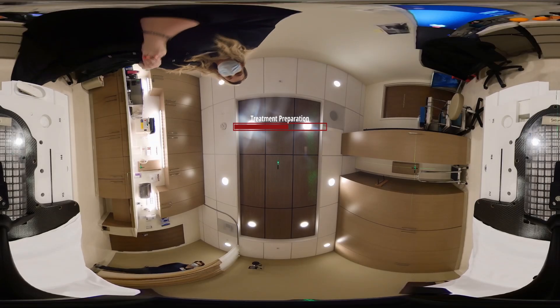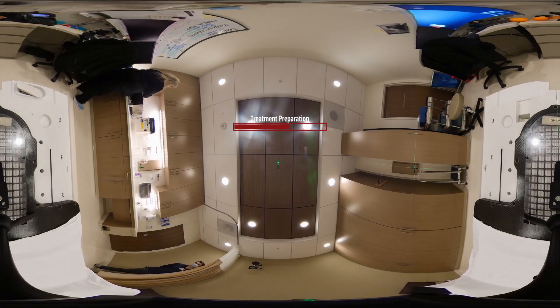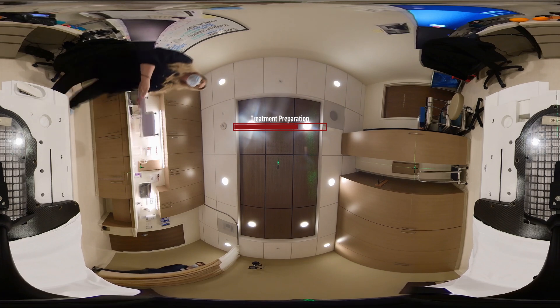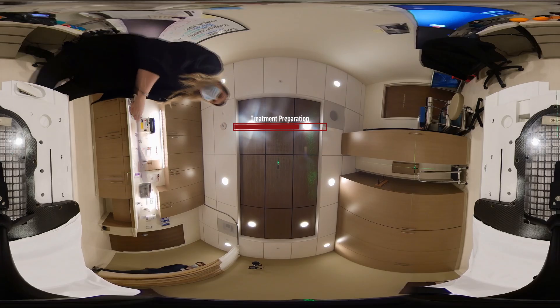I'm going to get your mask out of the water. Don't forget, it is going to be very, very warm to the touch. It is not going to burn you — it will cool quickly. Keep your eyes closed and continue to breathe. Here we go.